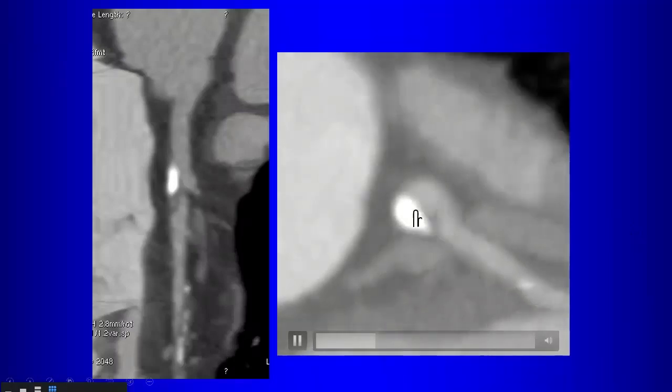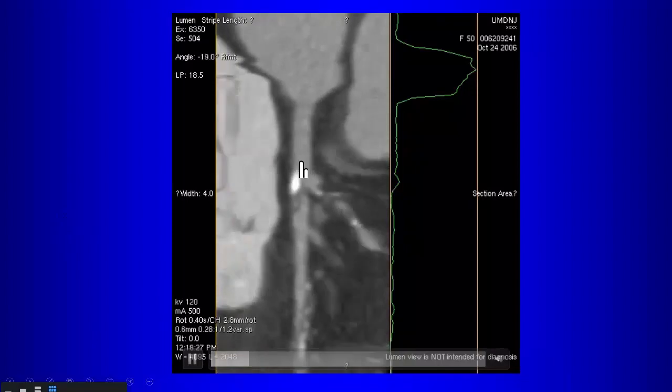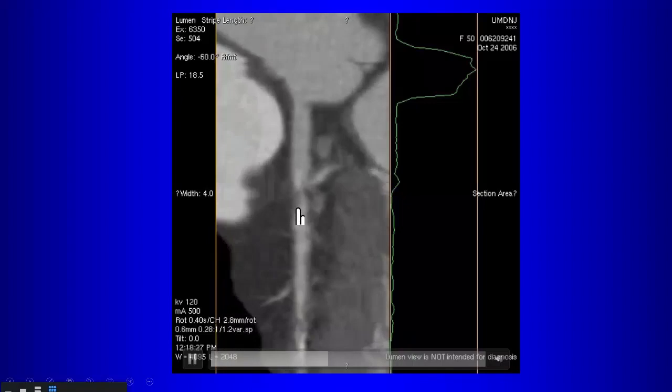And it is three-dimensional data. So you can go back and look at it and twist it around any way you want to see how much that plaque actually obstructs the lumen there, okay? And then you can take the vessel and actually straighten it out as if it's a piece of string. And you can do these reconstructions, and this is also three-dimensional, right? So we can twist it around and look at the plaque and see what it is doing to the lumen.